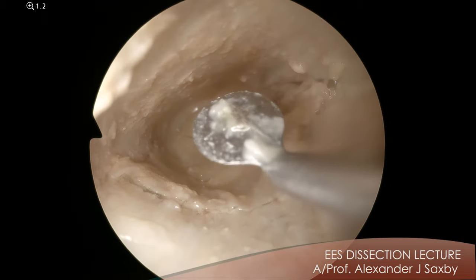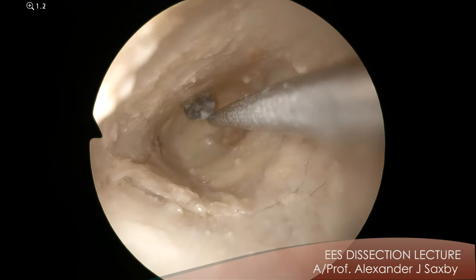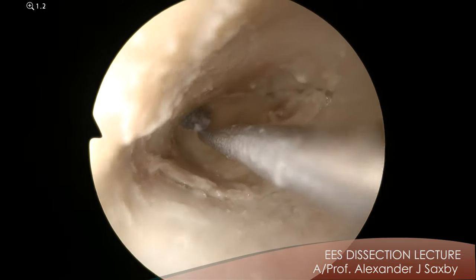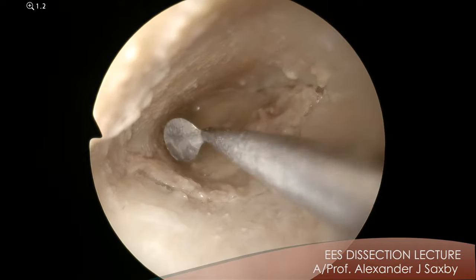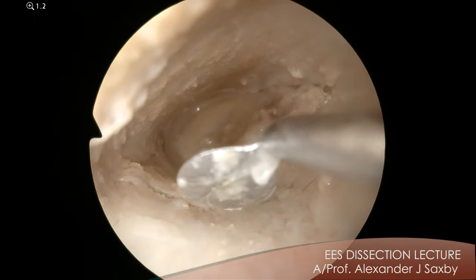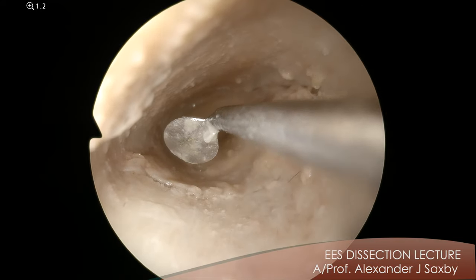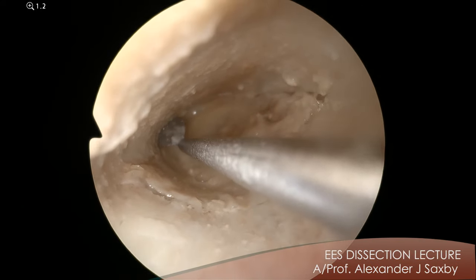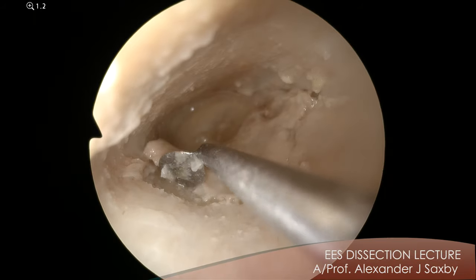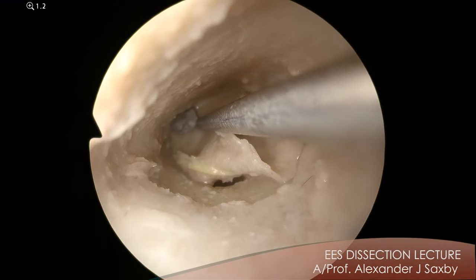Now for anatomy we go on to do something we won't do in real life — remove the drum entirely. So we make an incision to connect the other incisions around the front. It should come together perfectly. This is one reason I prefer not to use diathermy because diathermy shrinks it down and it granulates. So I prefer to tolerate a little bit of blood and get a perfect cut. So now we're going to remove the drum completely so that we can see the other anatomy.